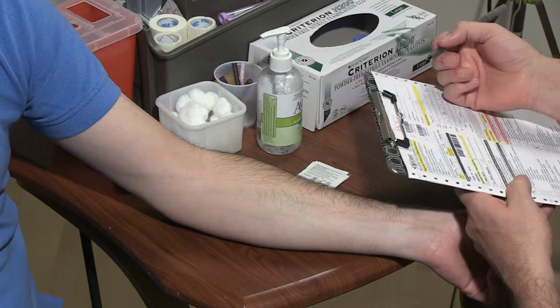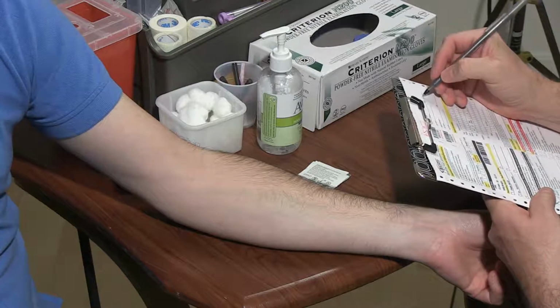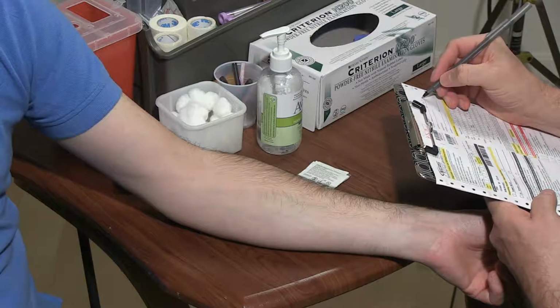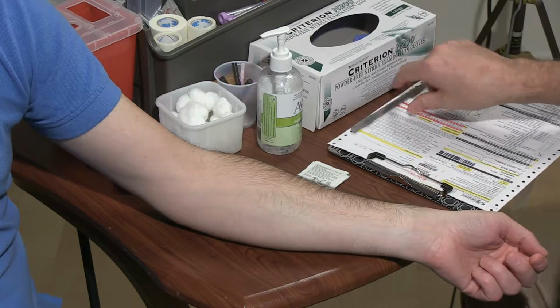Hello, sir. Can you tell me your name and your date of birth? Louis Strada. And your date of birth? April 2nd, 1976. Okay. We're going to draw a couple of tubes of blood for the lab work that your physician has ordered.